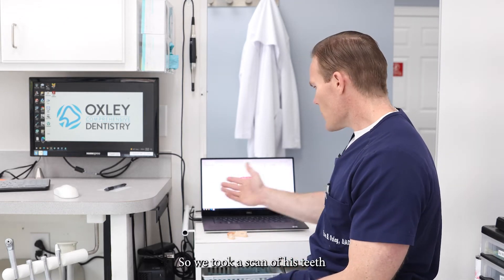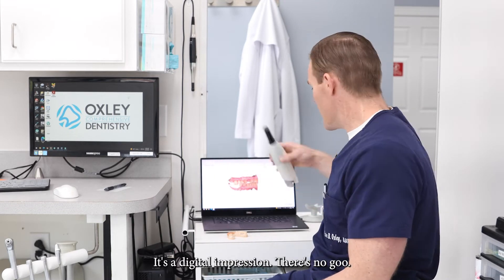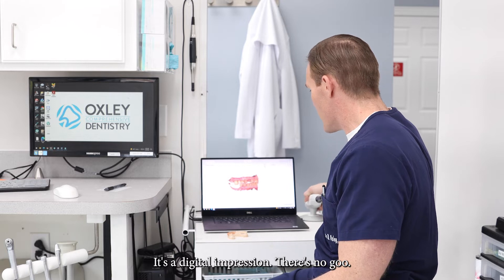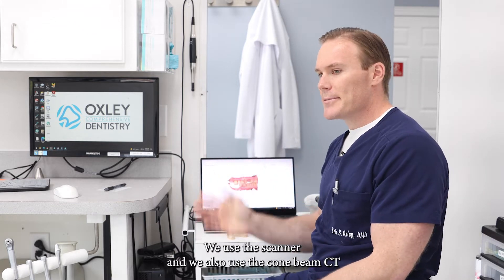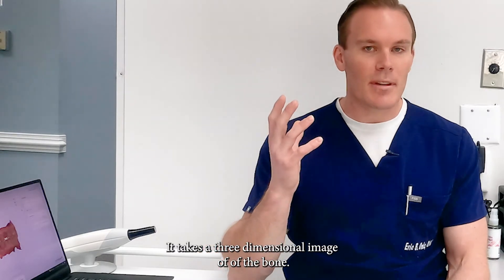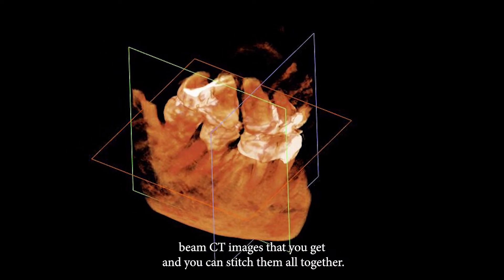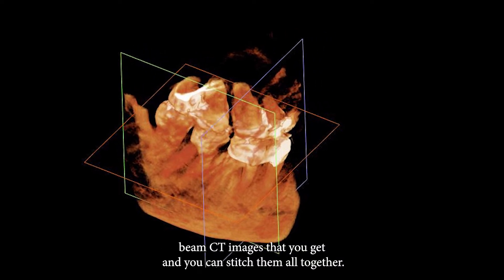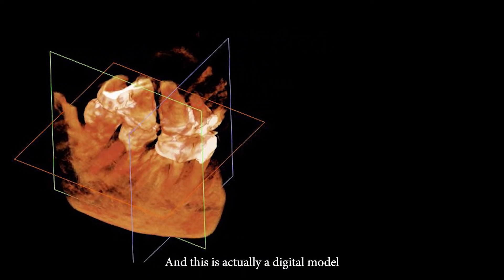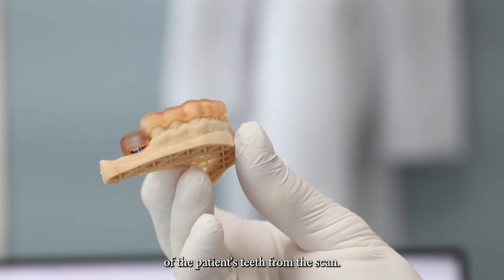We took a scan of his teeth with the TRIOS 3 scanner — it's a digital impression, there's no goo. We also use the cone beam CT, which takes a three-dimensional image of the bone. You can take the cone beam CT images and stitch them all together. This is actually a digital model of the patient's teeth from the scan.